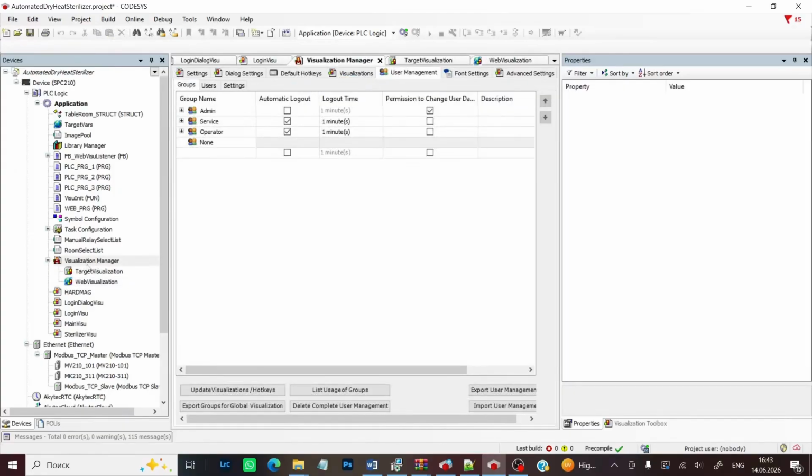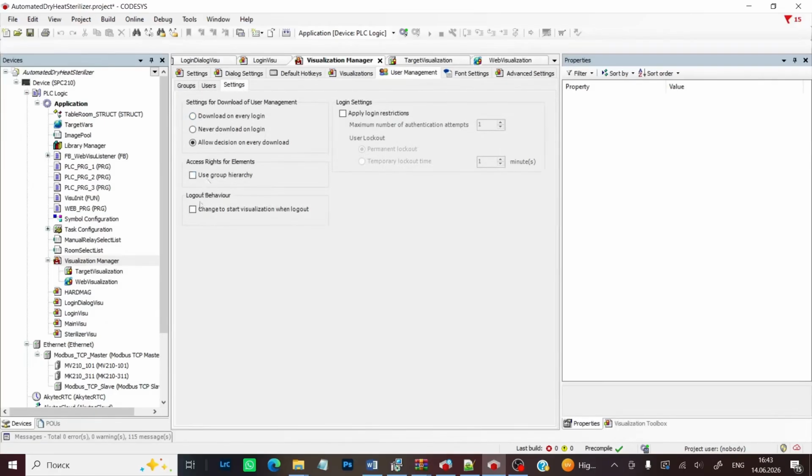In the Visualization Manager component, on the User Management tab, in the User Group settings, I disabled the automatic logout setting for the admin group, and on the Settings tab, I disabled the Change to Start Visualization when logout setting. I'll talk more about this setting a bit later.